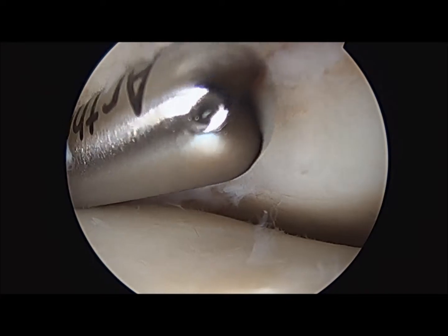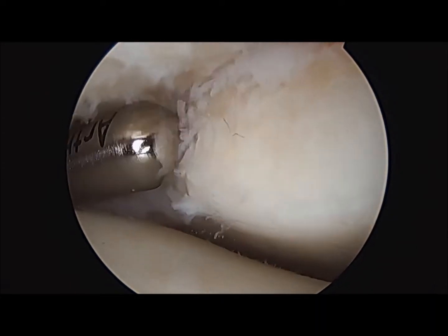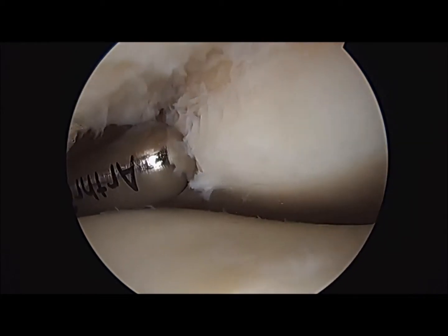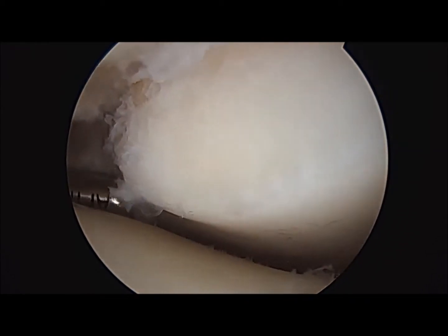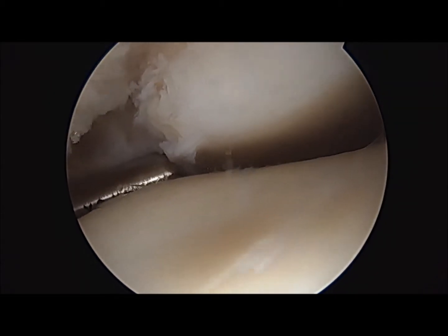This is the anterior medial gutter. We're going to go ahead and take some of this stuff out here. Copious amount of synovitis. Go ahead and take this out with a little bit of distraction. A little bit of suction.